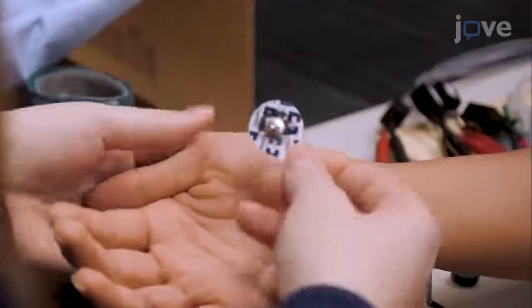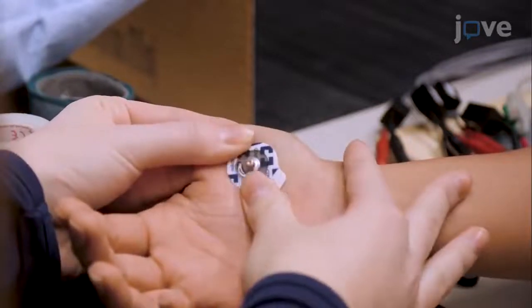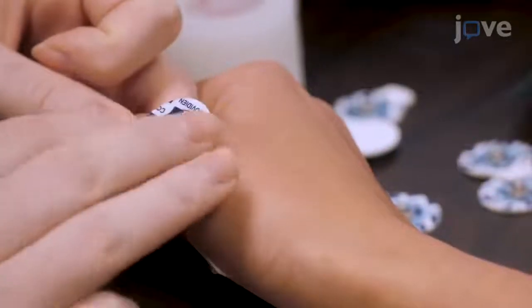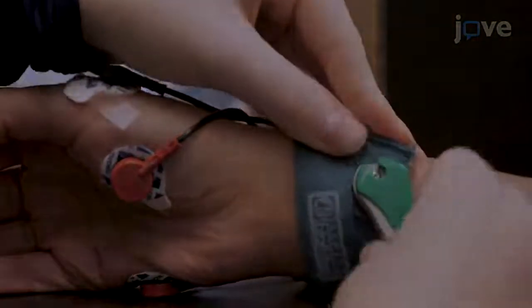Using a belly-tendon electrode arrangement, place one disposable silver-silver chloride electrode on the belly muscle, and another on a nearby bony landmark as a reference site on both hands of the participant. Then connect a ground electrode to the ulnar styloid process.